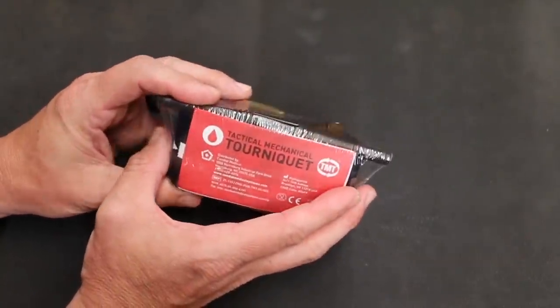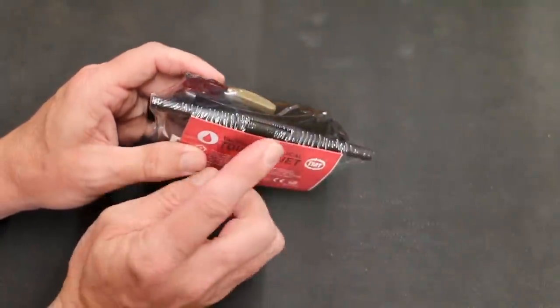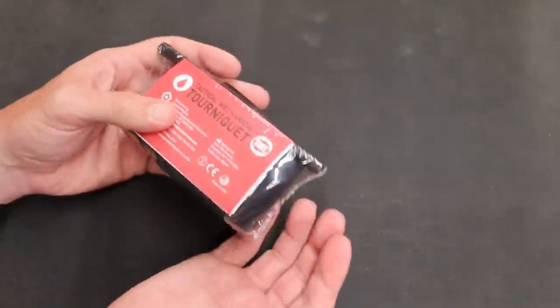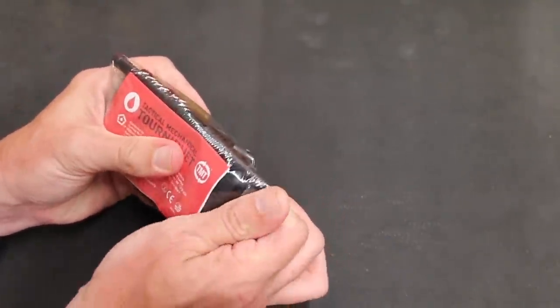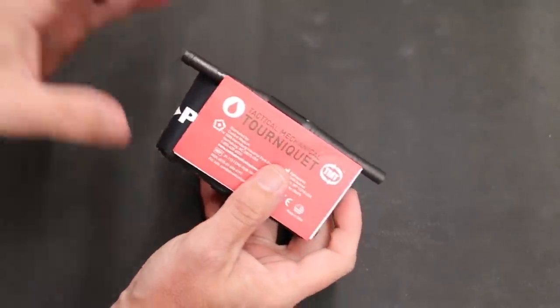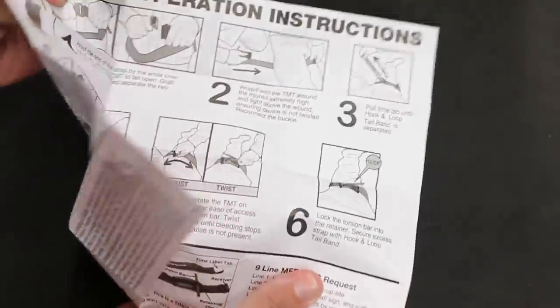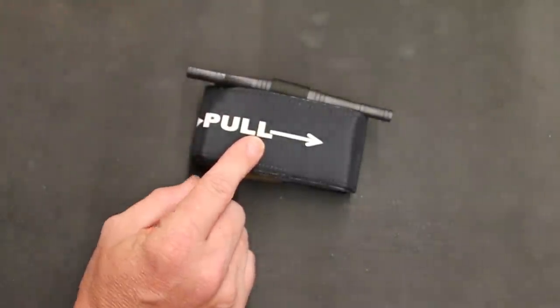Before we open it up, we want to show you the packaging. They have it staged the way they recommend. It does come sealed from the factory, so I would personally recommend you open it up, because trying to get this open with bloody hands and fingers could be a problem. You have some directions here, but under a moment of panic you may forget, so you could leave them with your tourniquet. I do recommend going ahead and taking it out of the packaging.